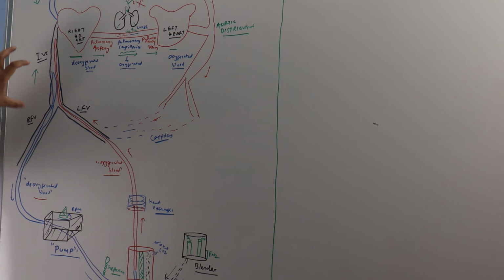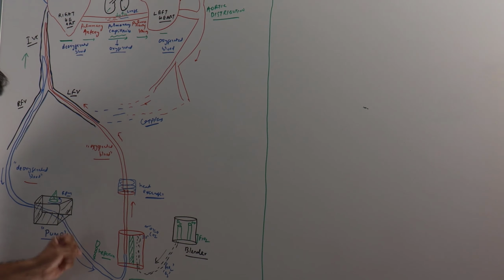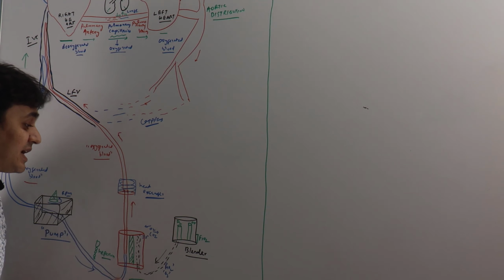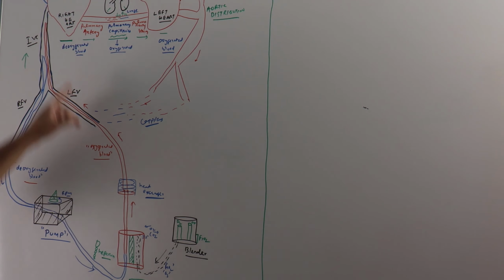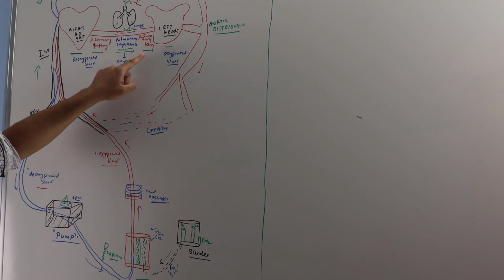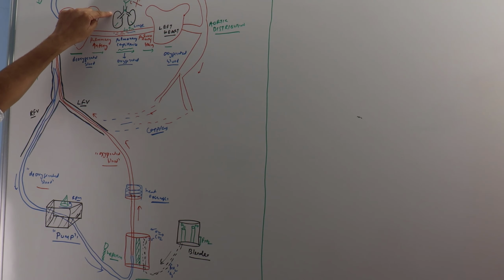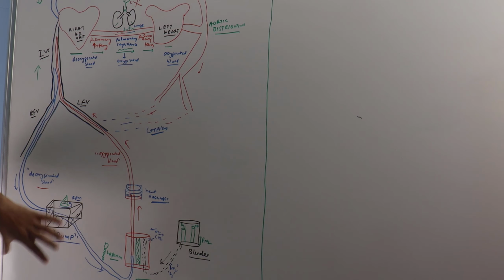So if you can take out the deoxygenated blood from the body, oxygenate it and remove the carbon dioxide outside of the body using an ECMO machine, then put the oxygenated blood into the right heart, from there it can go to the left heart using the same method. Now it is not dependent upon the lungs for gas exchange. So the left heart can now distribute that oxygenated blood to the whole body. So this is the principle of the ECMO machine.